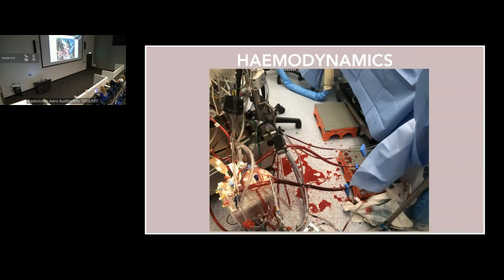All right, so during this phase, what can you do as a retrieval doctor to help manage the patient? Depending on how much circuit flow is achieved, the patient may need filling, as a lot of their cardiac output is being drained into the ECMO circuit, hopefully not onto the floor as in this case. So a lot of these patients have been diuresed to try and achieve a negative balance for their lungs, so filling them may be essential as you go on to try and get flow.